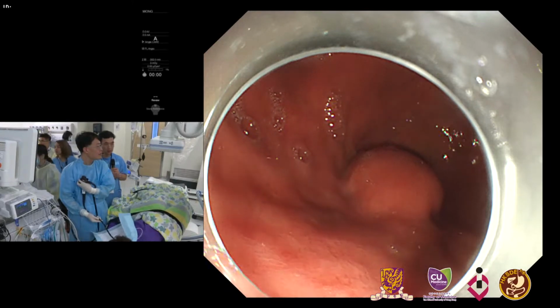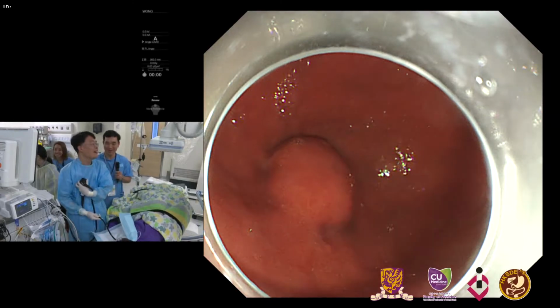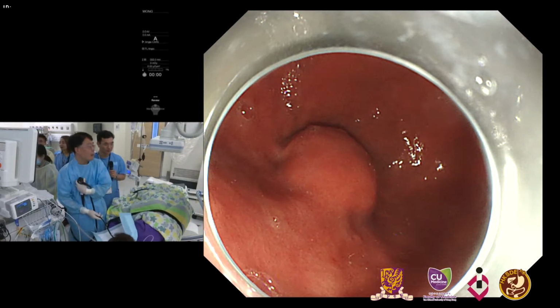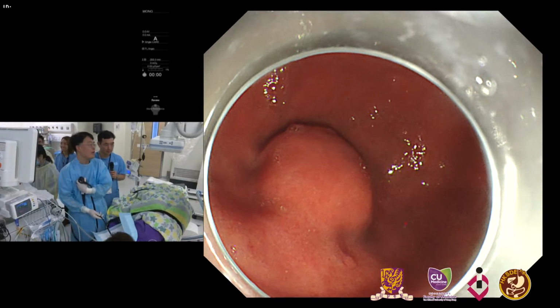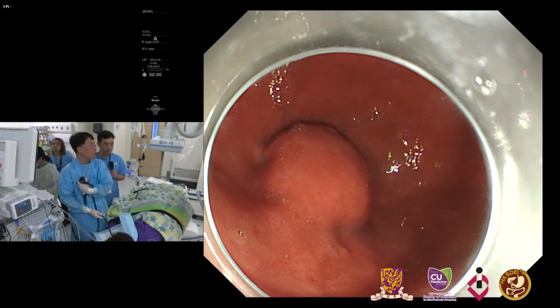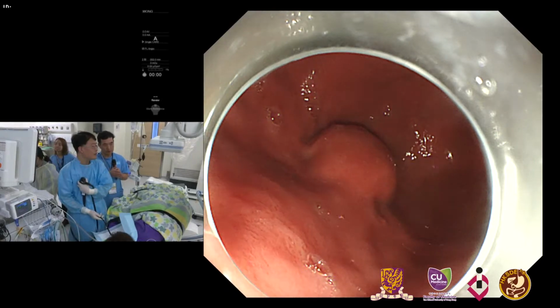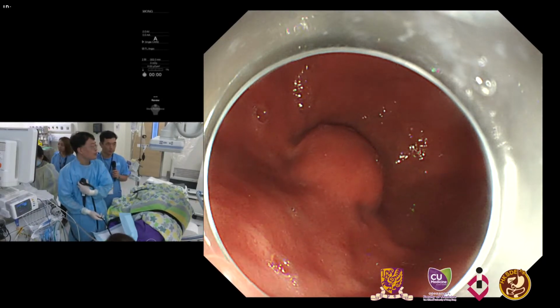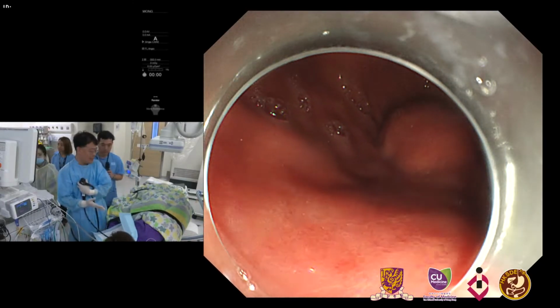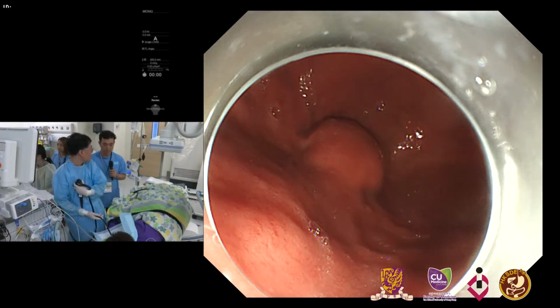The other possibility is to ask the surgeon to do laparoscopic surgery. But I think it's a very difficult place for the surgeon too, because with laparotomy or open surgery, it's very, very difficult to expose or resect the lesion. If it's an anterior side, probably it's much easier for surgeons. Yes, that's true. So I think, because the patient is only given general anesthesia, I want the patient to be intubated and remove the lesion.